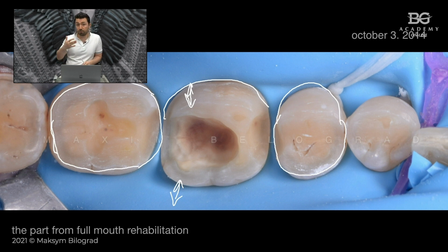On the upper jaw, it is a different approach. On the upper jaw, you can go for window preparation. On the upper jaw, you can go with a partial cusp reduction preparation. Lower first premolar, this one. We had to cover that cusp because it is prominent, it is high, the vestibular cusp is pretty high. So again, for aesthetic cases we do the same preparation, but in this case we are doing our functional rehabilitation. You know that the vestibular cusp is a stamp cusp, so actually a functional cusp. So we have to involve the cusp in the functional envelope and the functional rehabilitation.